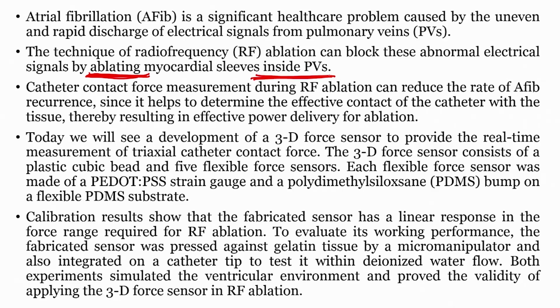So, when you want to burn, you have to apply RF frequency. So, radio frequency will generate heat, this heat will cause burning of the tissue.